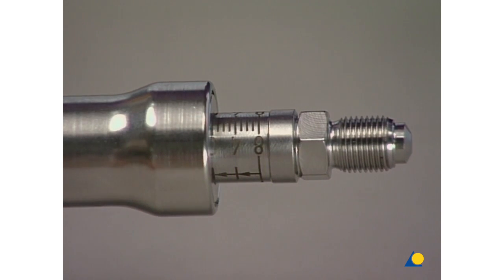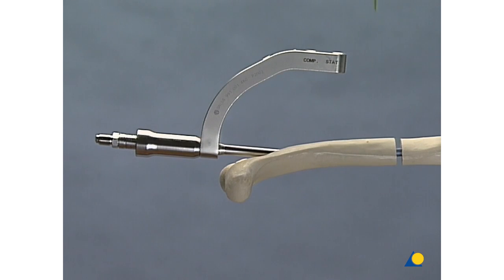The compression device may be used for antegrade or retrograde insertion. In this exercise, the UHN is inserted from retrograde and the fracture gap is measured.